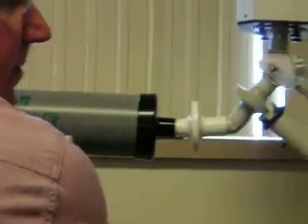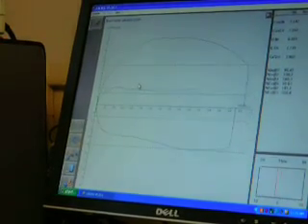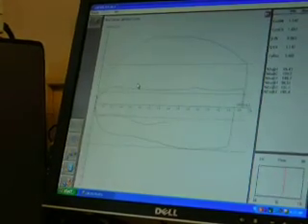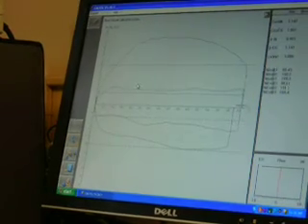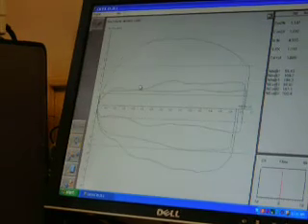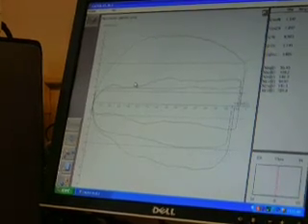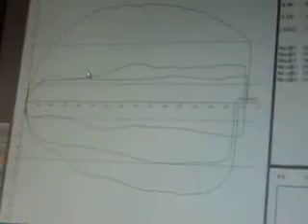And then you just have some practice pumps. Sometimes it comes loose. Let's see.